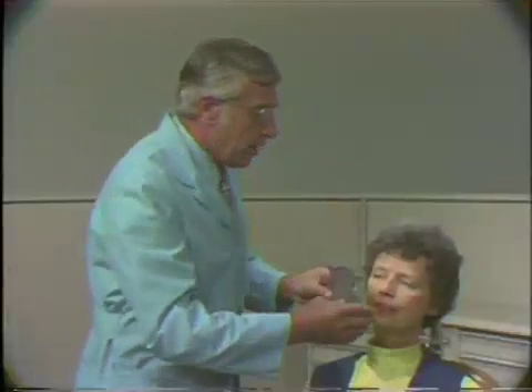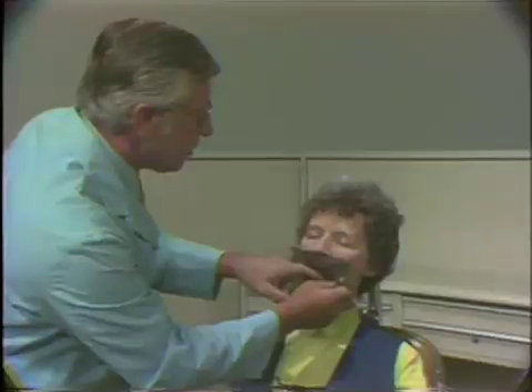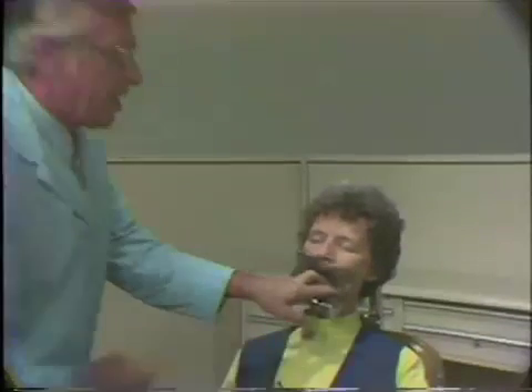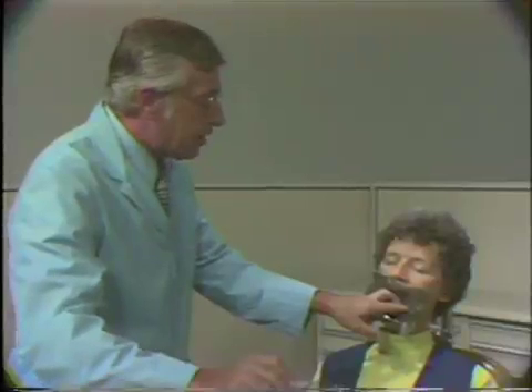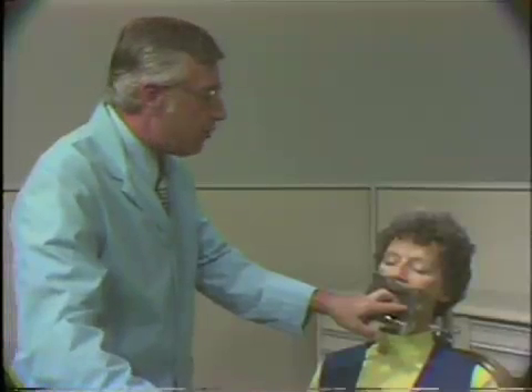For posterior teeth, either two or three methods may be used. One, the hole in the rubber dam is carried to the tooth and the tooth is isolated by placing the hole over the tooth in question. In this instance, the appropriate wingless bicuspid clamp would be placed in position to maintain the rubber dam. The other method is to have the winged bicuspid clamp placed in the hole and then carried to the tooth, after which the rubber dam must be removed from the wings of the clamp.